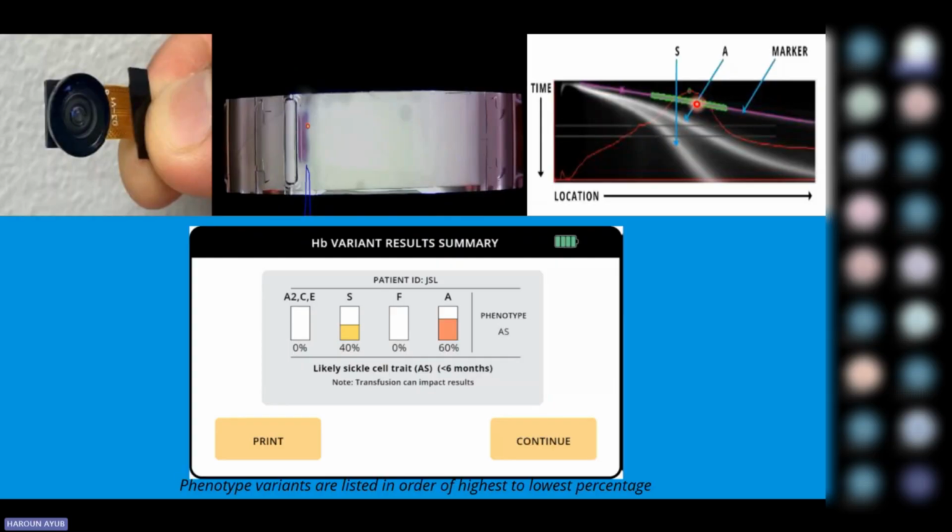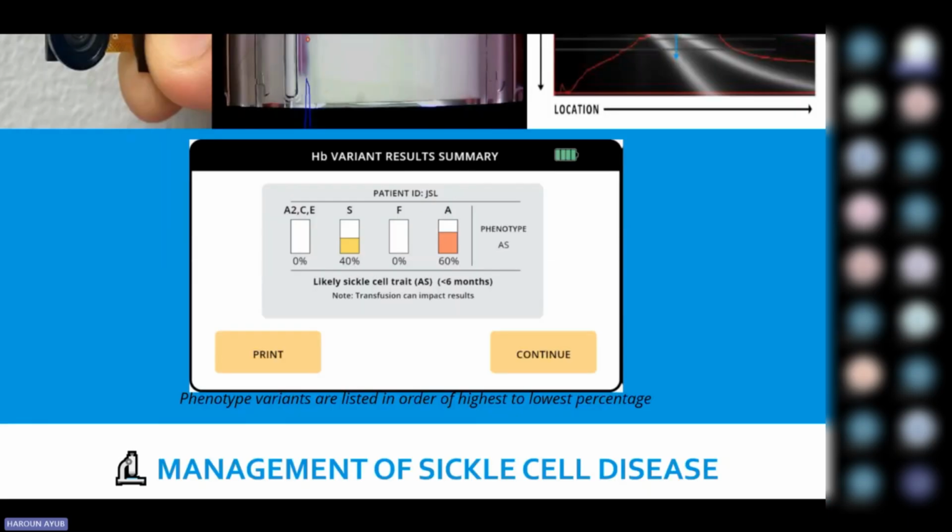Issues to do with the marker fluid not migrating will be either that it is expired, or it has exceeded the open vial stability, and so on. Those are some of the things that our clients will use in terms of troubleshooting, and then it gives us the representation in a percentage, and then we evaluate.